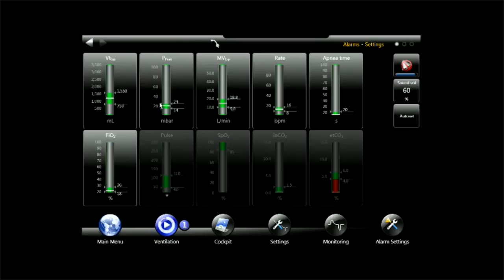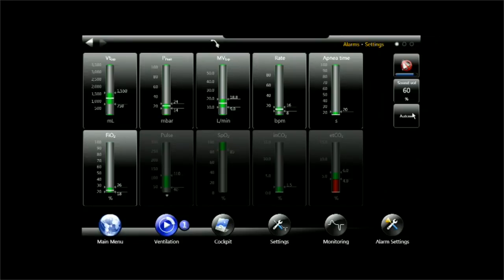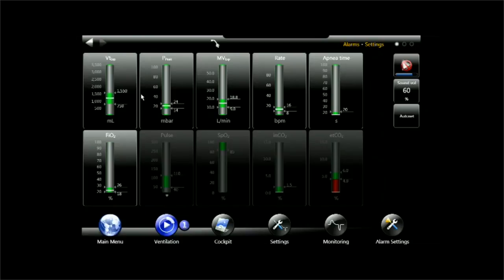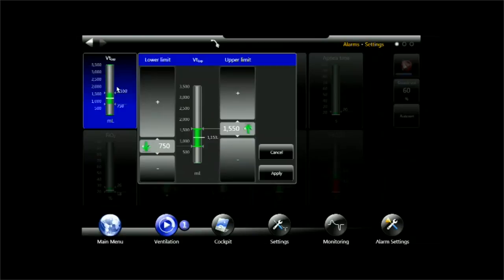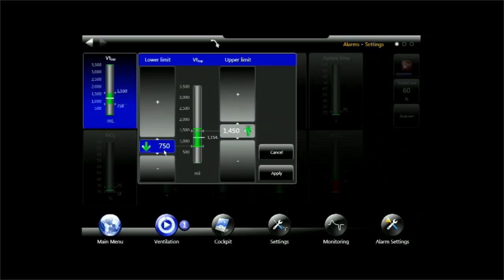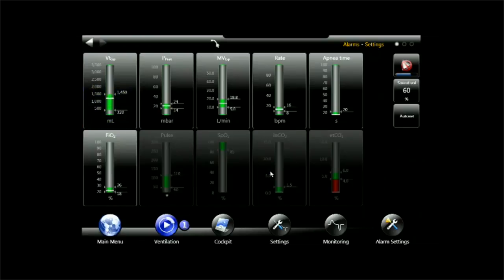Now some of these alarm limits are really narrow and AutoSet also compromises alarm limits which may have been carefully set for a patient. So if the caregiver carefully sets alarm limits for a certain patient and then the nurse comes and hits AutoSet because it's so quick and so convenient, this can be very dangerous.